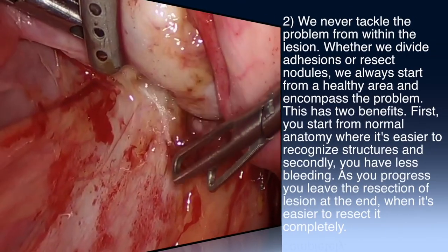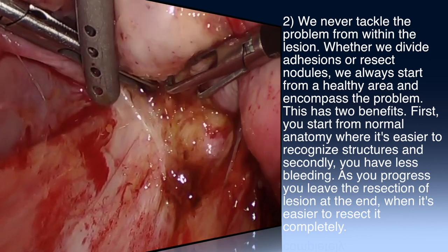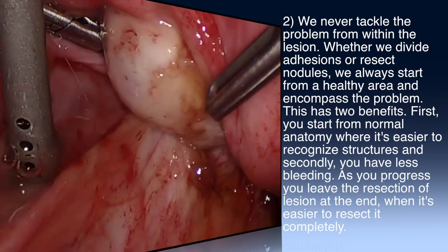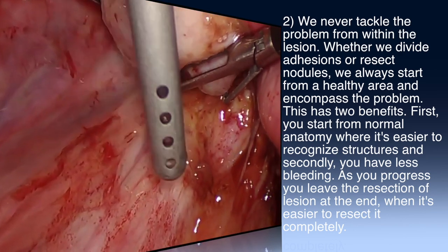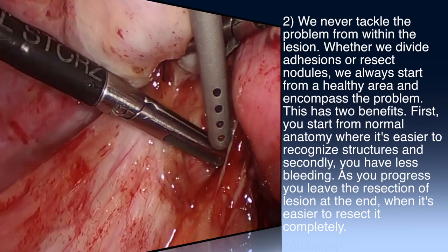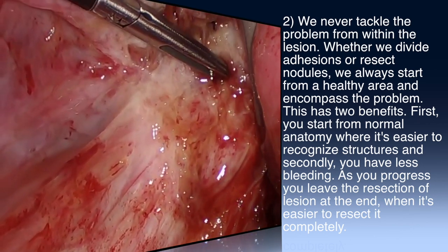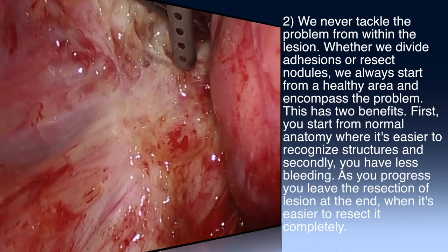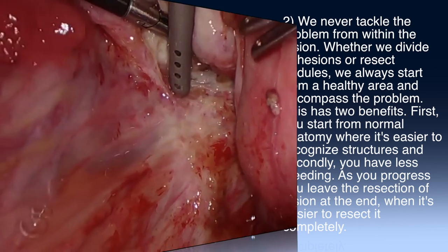We never tackle the problem from within the lesion. Whether we divide adhesions or resect nodules, we always start from a healthy area and encompass the problem. This has two benefits: first, you start from normal anatomy where it is easier to recognize structures, and secondly, you have less bleeding. As you progress, you leave the resection of the lesion at the end, when it is easier to resect it completely.